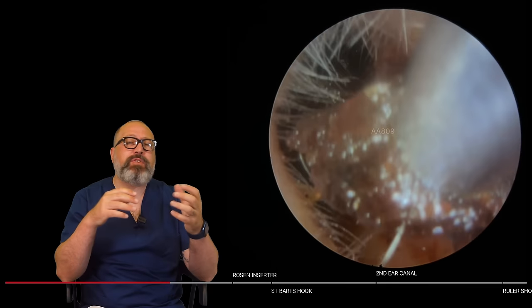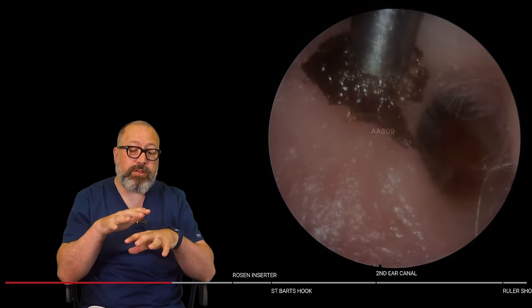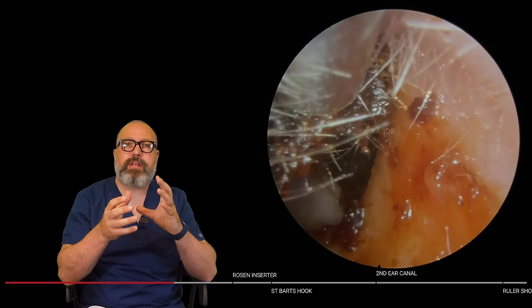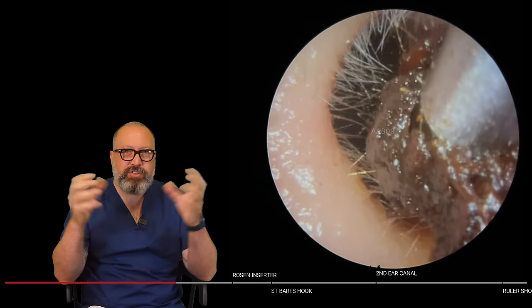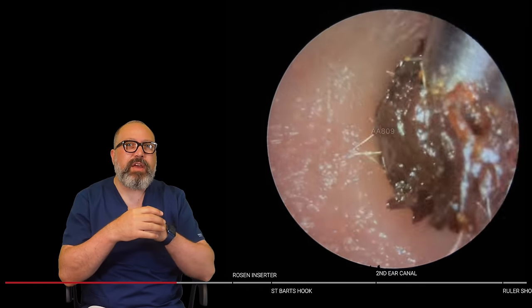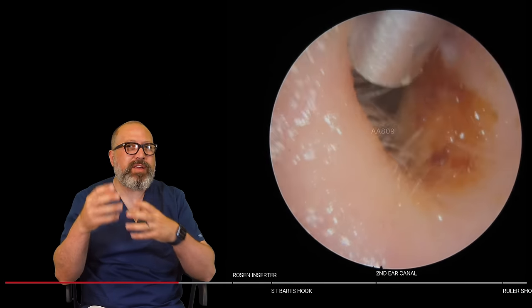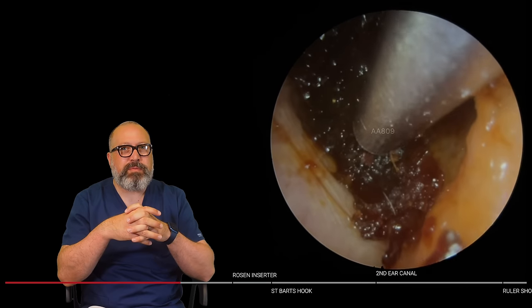And it's always the case when you've loosened the wax plug up a little bit, especially with these ones which are all pieces almost welded together. When you start to loosen that plug up, you get a bit more space in there, everything's got that little bit more room to move, and then it starts coming away a lot more freely. So it's always that first couple of minutes as you're breaking down that compacted plug that's a problem, and then it opens up a little bit from there.